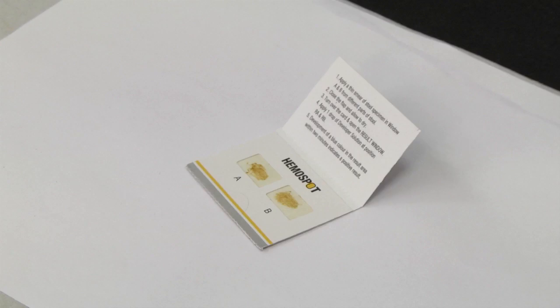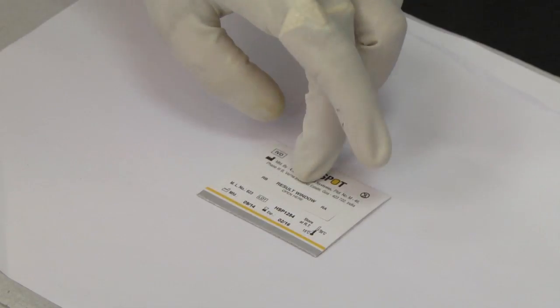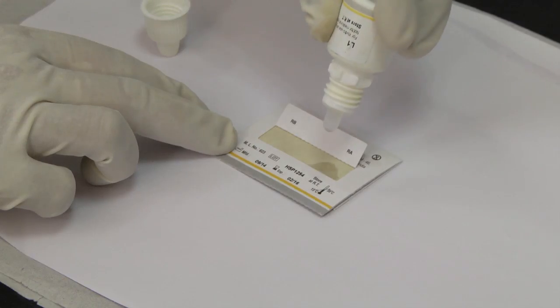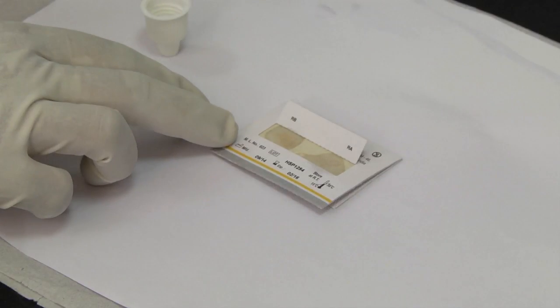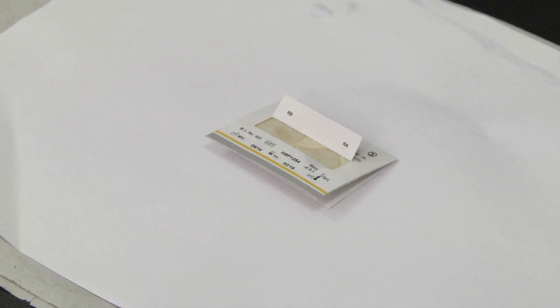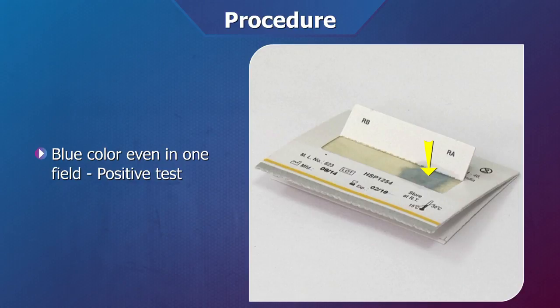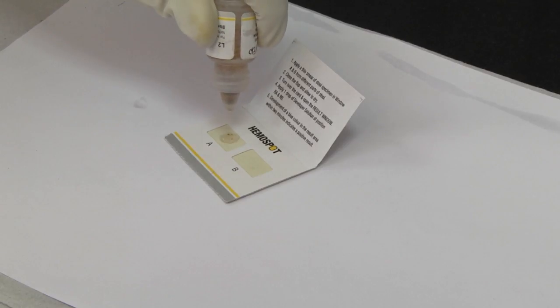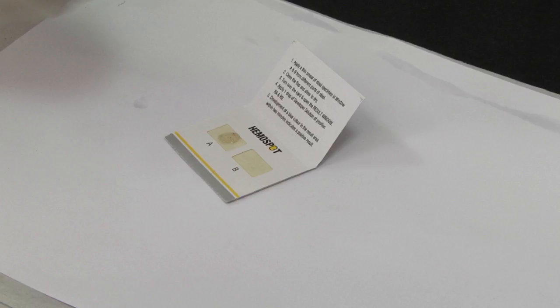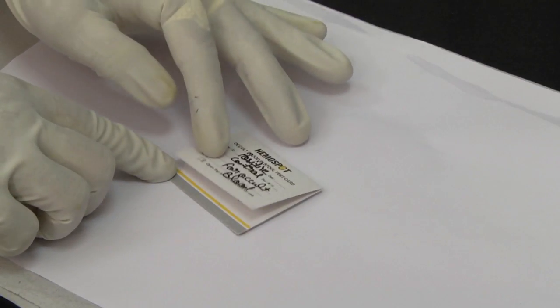Wait until the smeared sample has dried completely. Turn over the test card, open the result window, and add one drop of developer to fields RA and RB — the reverse side of the sample smeared on the sample application windows respectively. Observe for color change exactly at 2 minutes. Even if one of the fields has a blue color, the test is positive for occult blood. Positive control available with the kit should be run along with the test samples to assess the efficacy of the test cards.